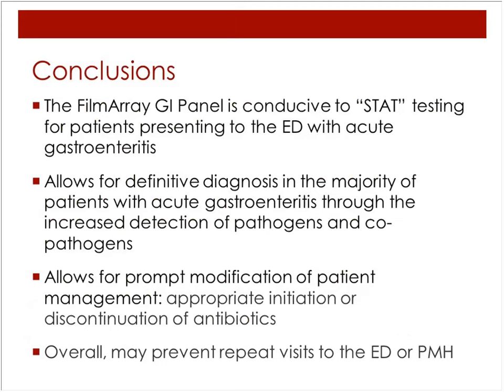So in conclusion, the FilmArray panel is conducive to stat testing for patients presenting to the ED with acute gastroenteritis. It allows for a definitive diagnosis in the majority of patients with acute gastroenteritis, and it allows for an increased detection of true pathogens as well as co-pathogens. It also allows for prompt modification of patient management, where you can appropriately initiate or discontinue an antibiotic. And then overall, it may prevent repeat visits to the ED or the primary medical practitioners.